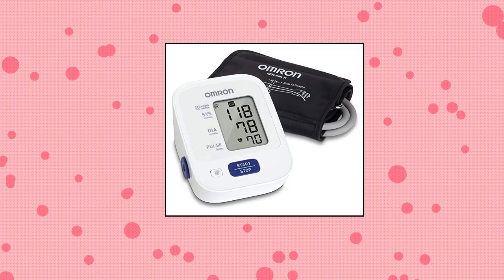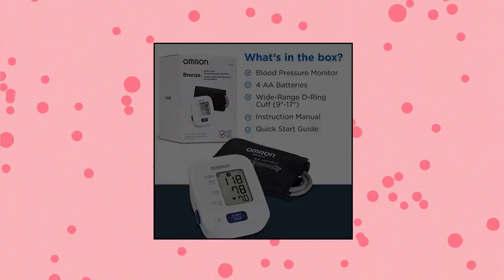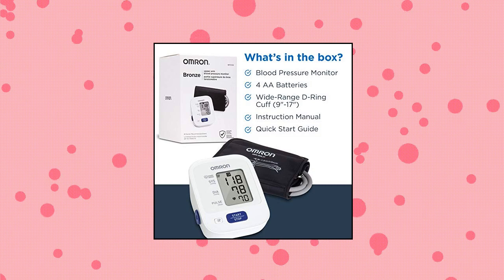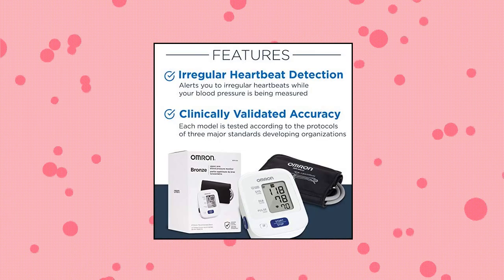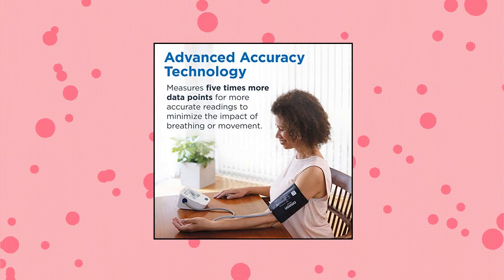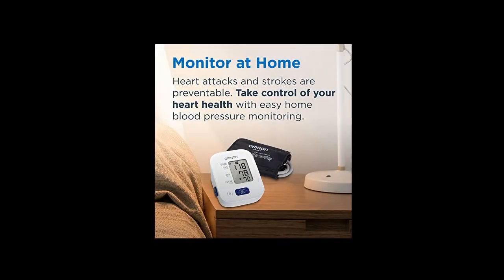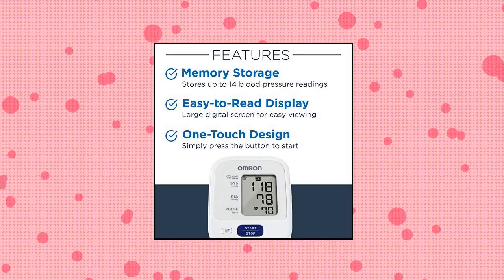Omron Bronze Blood Pressure Monitor, upper arm cuff, digital blood pressure machine. The Omron Bronze upper arm monitor stores 14 total blood pressure readings for one user. It captures readings and any irregular heartbeats and body movement during measurement. The Bronze monitor features one-touch use and body movement detection to help ensure easy use and accurate readings. The Bronze cuff fits all large and standard adult upper arms 9 to 17 inches in circumference, with a soft, wide D-ring cuff designed for a more comfortable measurement.